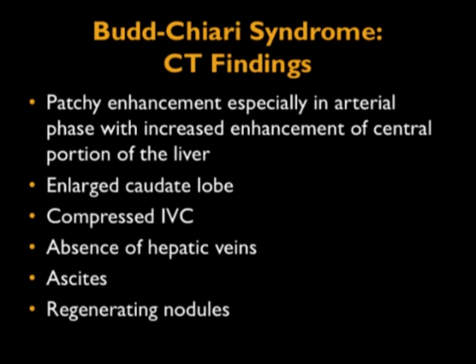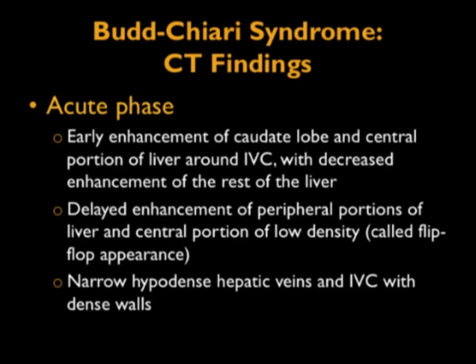In Budd-Chiari syndrome, CT findings include patchy enhancement especially in the arterial phase, with increased enhancement of the central portion of the liver — a flip-flop phenomenon. You can see a large caudate lobe, compressed IVC, absence of hepatic veins, ascites, and regenerating nodules. In the acute phase, you see early enhancement of the caudate lobe and central portion around the IVC with decreased enhancement of the rest of the liver — centrally bright, peripherally decreased — then delayed enhancement of the peripheral portions, while the central portion becomes low density. Narrowed, hypodense hepatic veins and IVC with dense walls can also be seen.